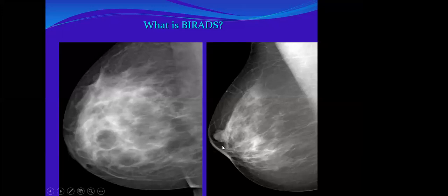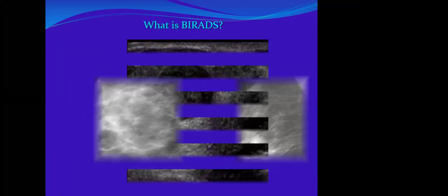Developing asymmetry. So yes, I'll say developing. If you did not see the previous, if you have seen it only here, how will you describe it? I will describe it as a mass. Excellent. A mass. Which mass? How do you describe the mass? It's partially obscured. Excellent. It's a partially obscured mass.